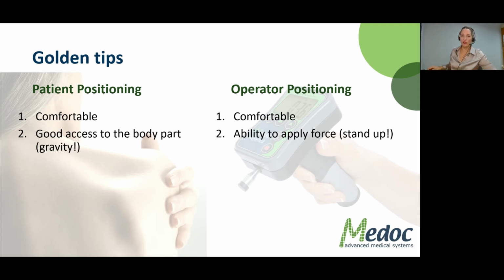Especially as I often see this, people are testing a patient. He's sitting down in front of me. They're testing their trapezius muscle, and they're also sitting down because it's comfortable and we're all tired, and they start applying pressure like this, and then at a certain point in time you don't have enough force anymore in your shoulders. If you would stand up, it would be easily done, and you can just lean in and apply more pressure to reach the pressure pain threshold of your patient.